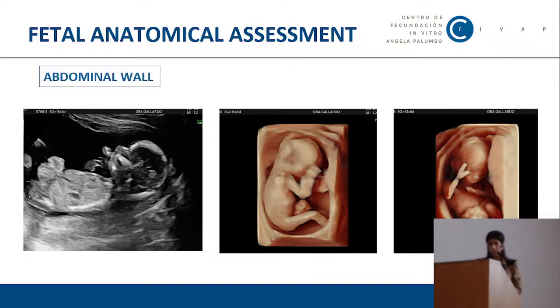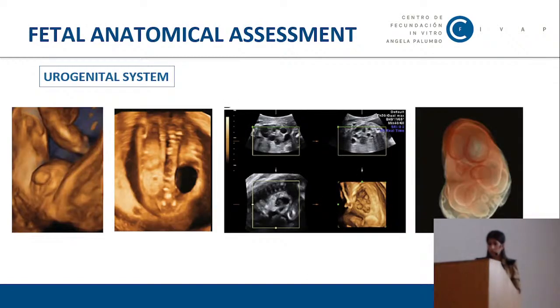We have also a picture of the urogenital system, megaclitoris in a female genitalia, hydronephrosis, and here we have a polycystic kidney in the multiplanar display, and in the render mode we can see all the cysts. We can take and isolate this kidney. We can isolate it with an electronic scalpel and use the silhouette mode where we can see not only the surface of the kidney but also the cysts inside.